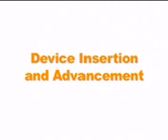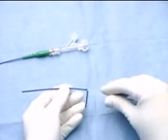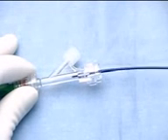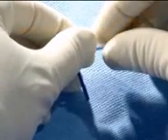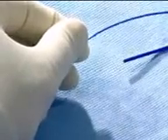Device insertion and advancement. Carefully insert the tip of the sheathed protection wire into the peel-away introducer. Then insert and advance the entire assembly into the hemostasis valve attached to a guide catheter or guide sheath. The minimum inner diameter of the guide catheter or guide sheath must be 0.066 inches. Once the device has been advanced into the guide, peel away and remove the introducer.